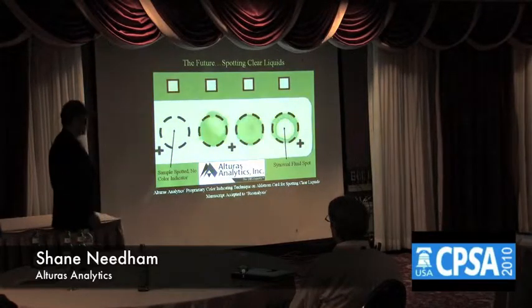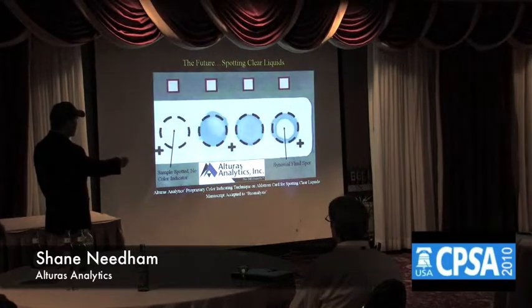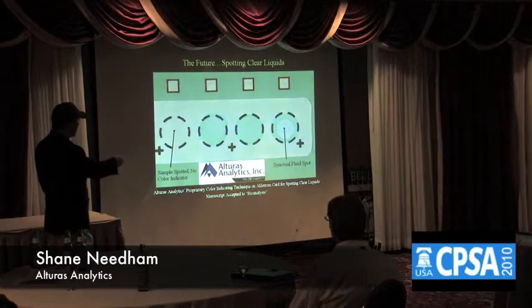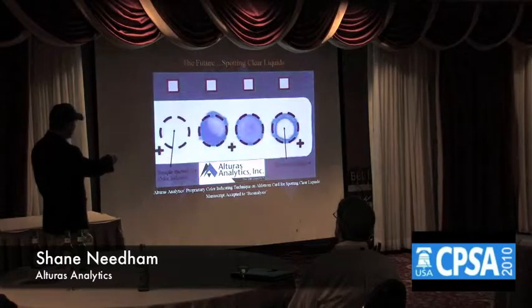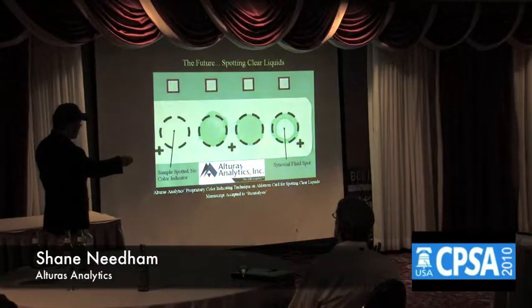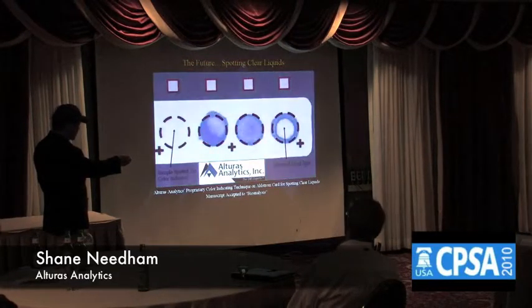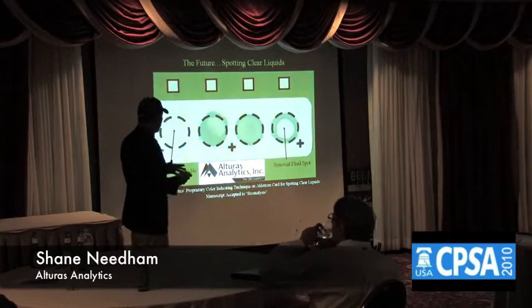And this is some of the technology that we've developed. This is a proprietary technology where we add a color indicating dye to these commercially available cards. In this previous application with just a conventional card, you spot your synovial fluid spot here. You can't see it. These are just duplicate samples of the dye. By the way, the internal standard is added at the same time, which improves accuracy and precision. But now you spot your synovial fluid spot. Very accurate, very precise, very homogeneous, just like dried blood spot, but you can perfectly see exactly where that spot is, where your synovial fluid is. So now you can take a punch, extract it, and analyze. Again, very exciting to be a part of this.